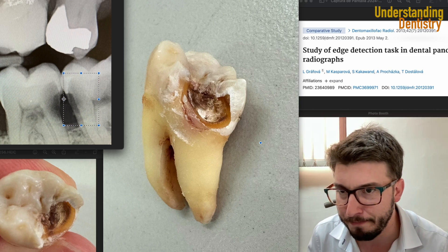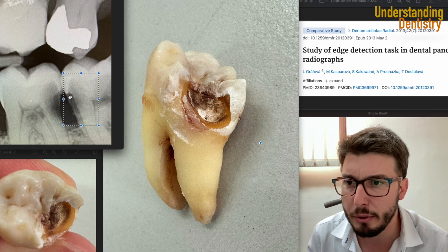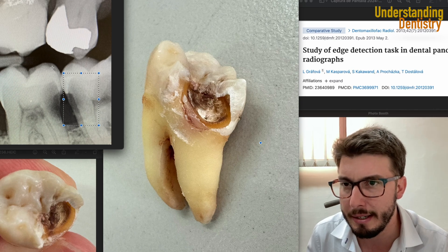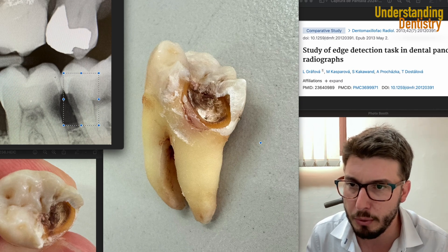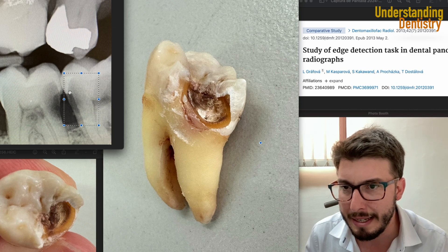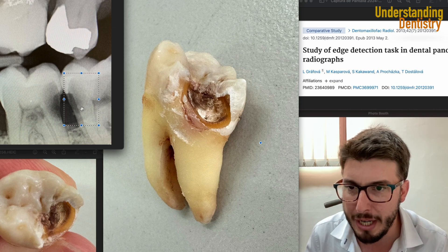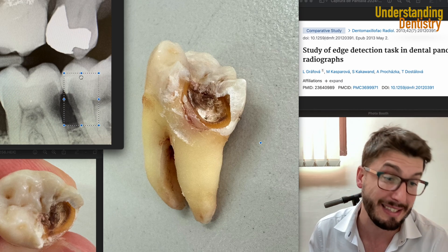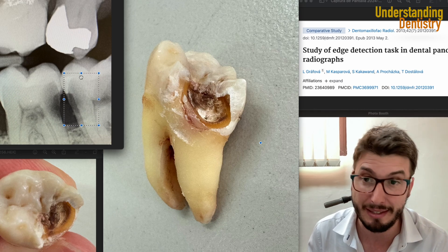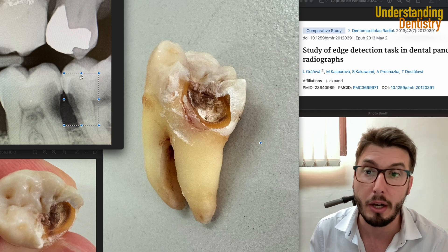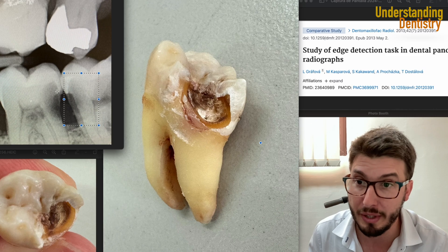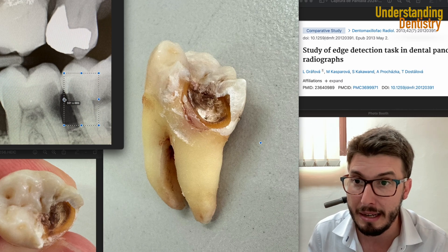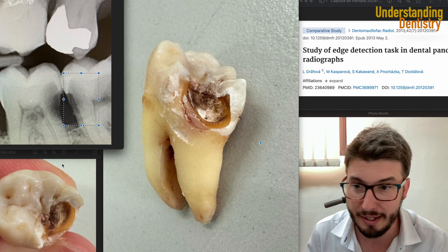So we have this caries here — the image is a little bit tilted on this radiograph. Is the caries already very close to the pulp chamber or not? Sometimes the radiograph underestimates the true loss of tooth tissue, and that's basically the bottom line here.